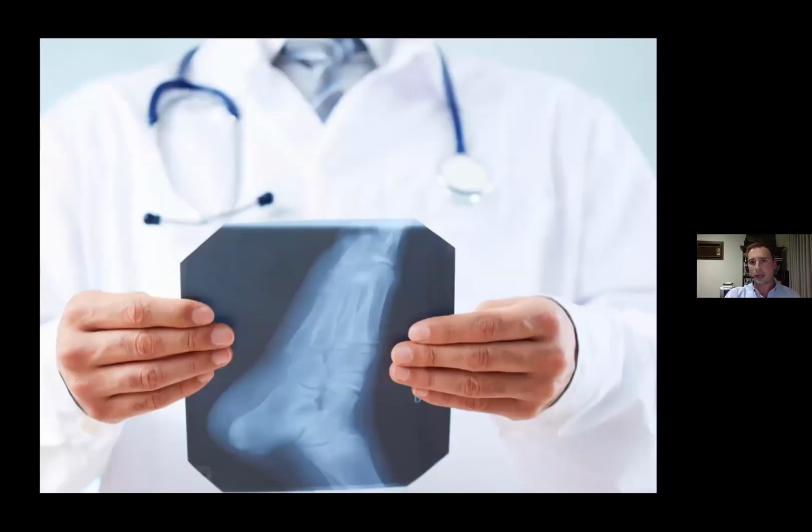When it comes to getting good outcomes with shockwave, the primary thing is that fancy technology does not replace clinical expertise and a thorough clinical exam. It's important to have an accurate diagnosis. If you've got an incorrect diagnosis, for example, a misdiagnosis between an insertional Achilles tendinopathy versus a retrocalcaneal bursitis, shockwave's not going to do a whole lot for retrocalcaneal bursitis. This is more of an inflammatory, friction-based problem.